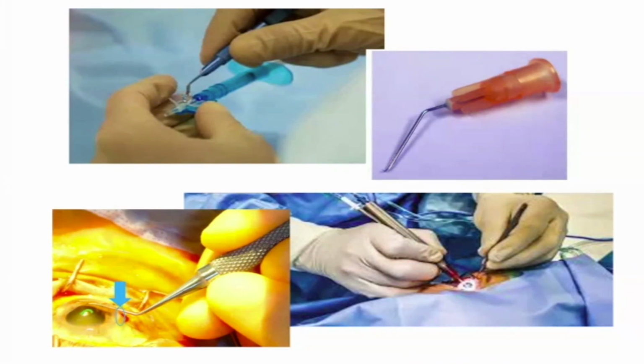Don't even know how to do the lens, but you say that you want to go for the sculpting or something like that? No. Usually we always teach you and start you from the step behind, which is a very safe step. So you already show us you can load the lens quite well, and are able to implant the lens. Then it's much easier for us to bring you to the next step, the next level.